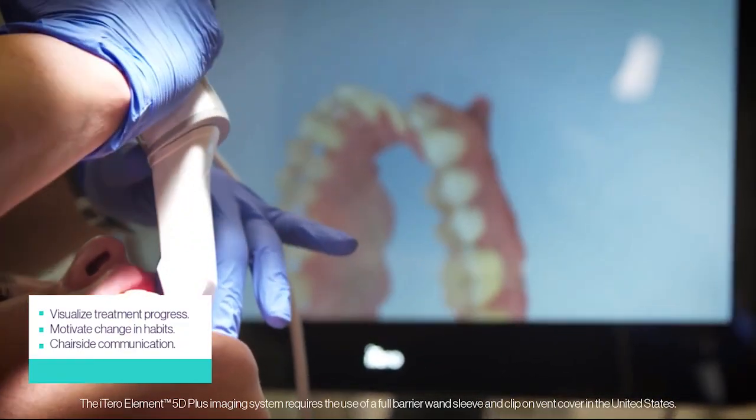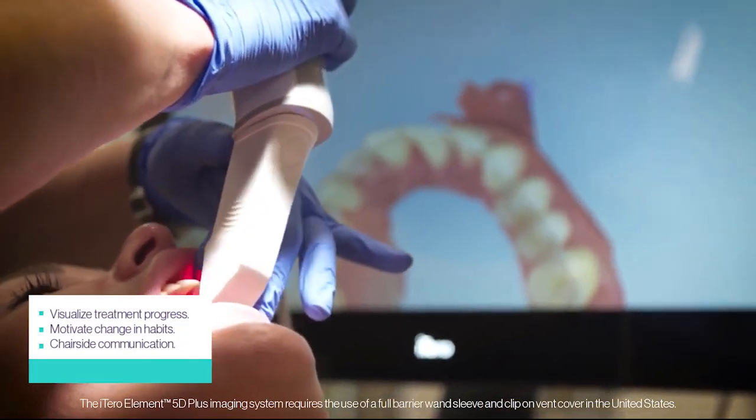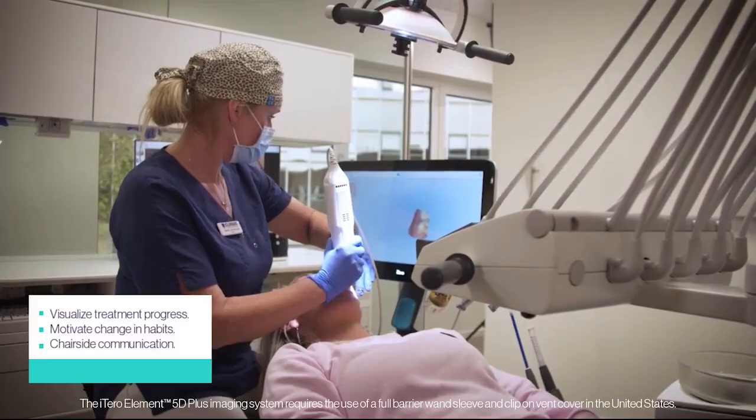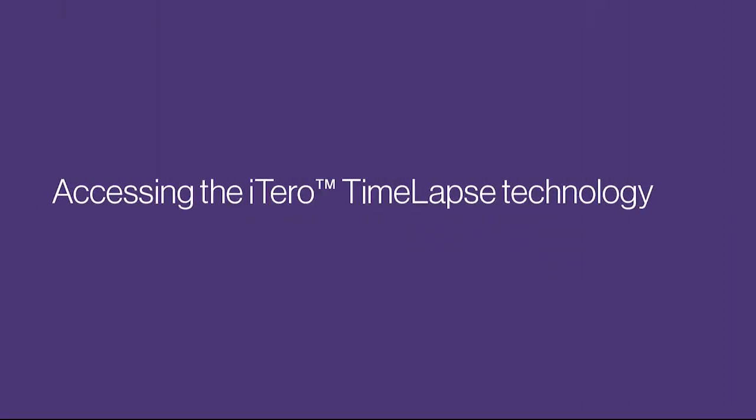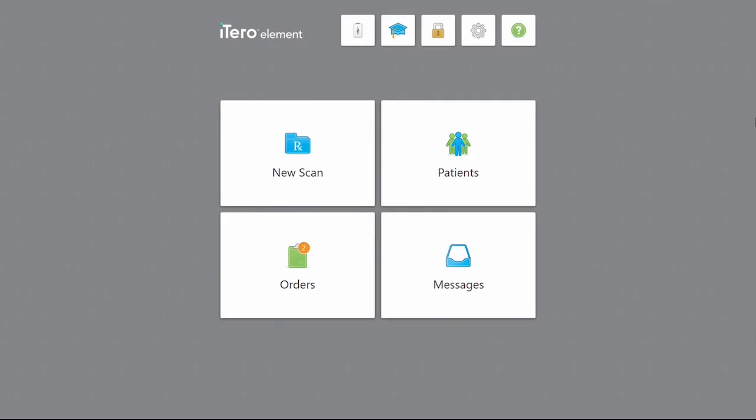The comprehensive visuals can motivate habit change, optimize chair-side communication, and encourage treatment acceptance. Let's review the iTero time-lapse technology workflow on the scanner screen.